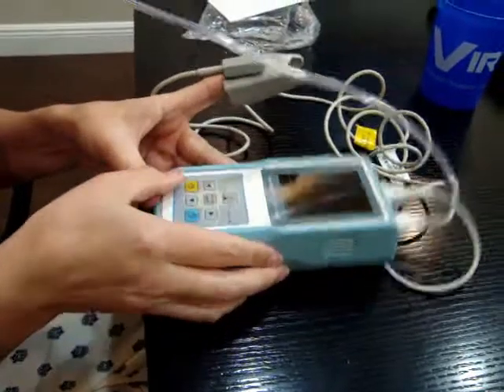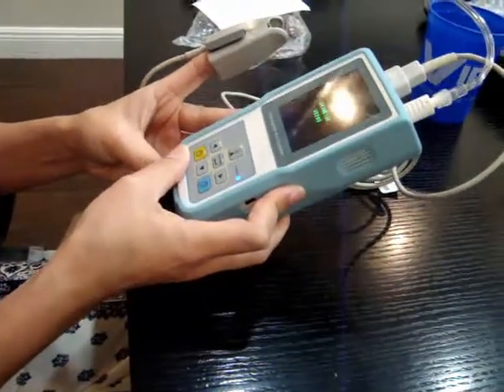Step 4: Put the device on the night table, then press the bottom left button until powered on.